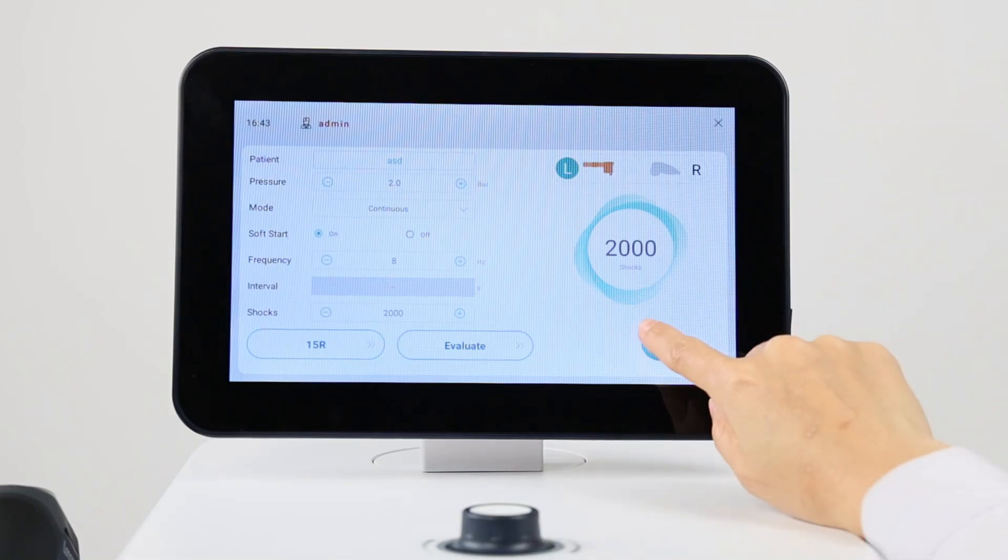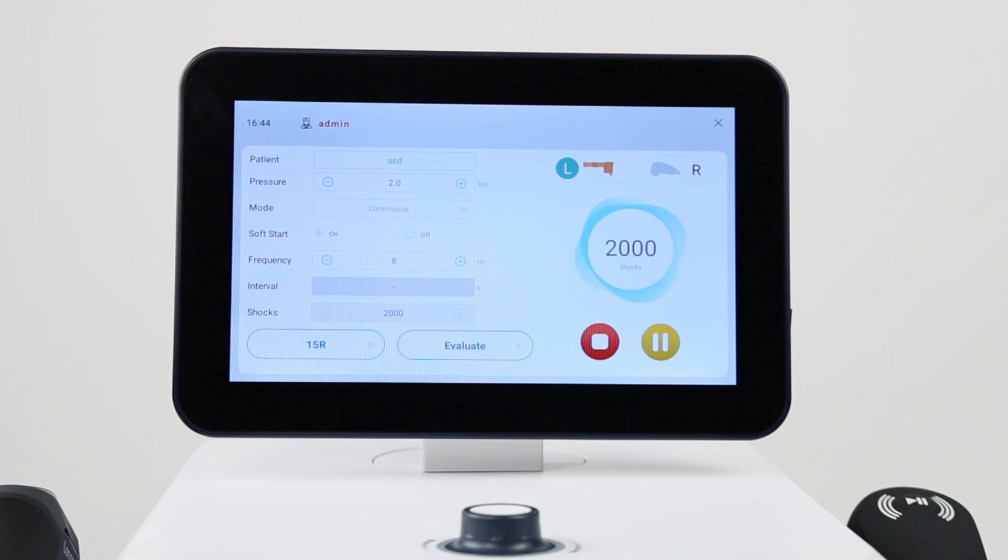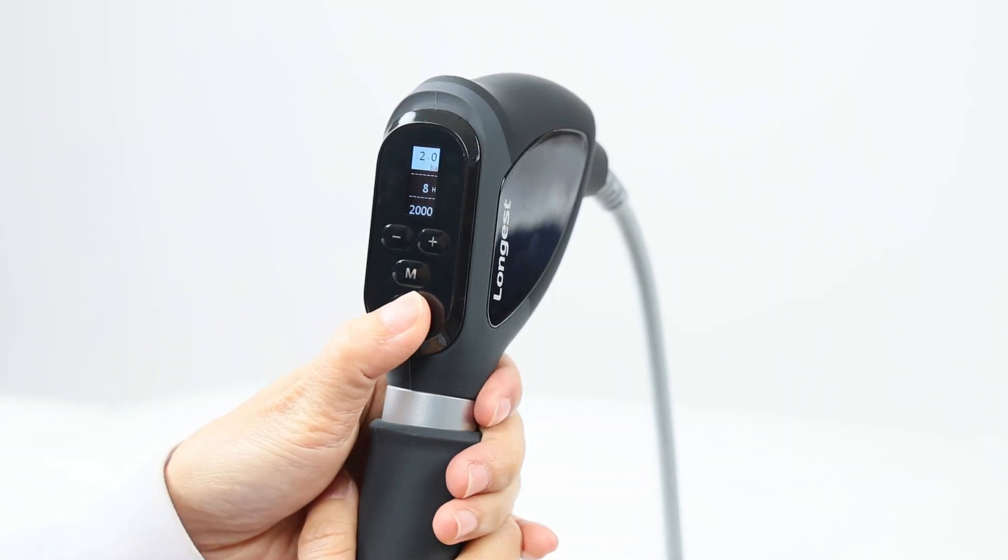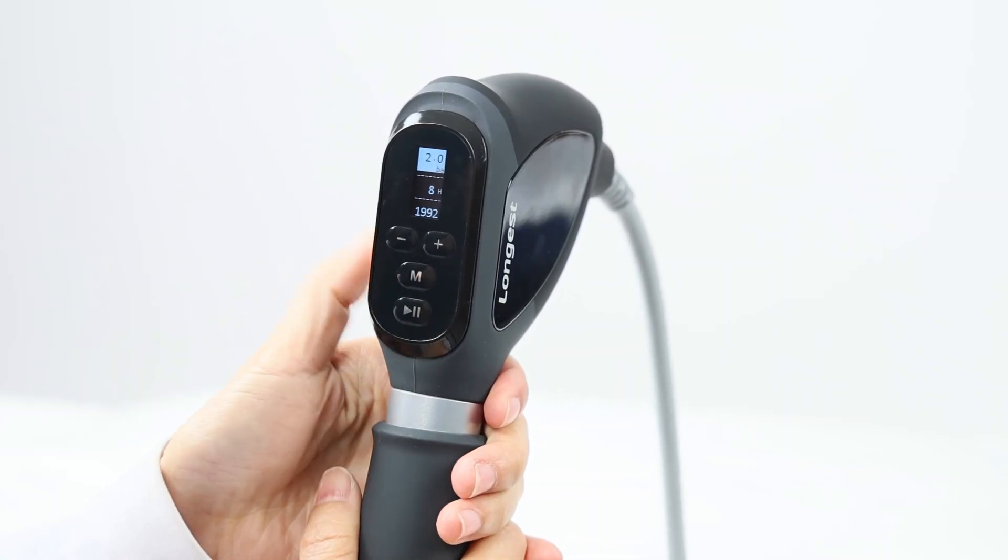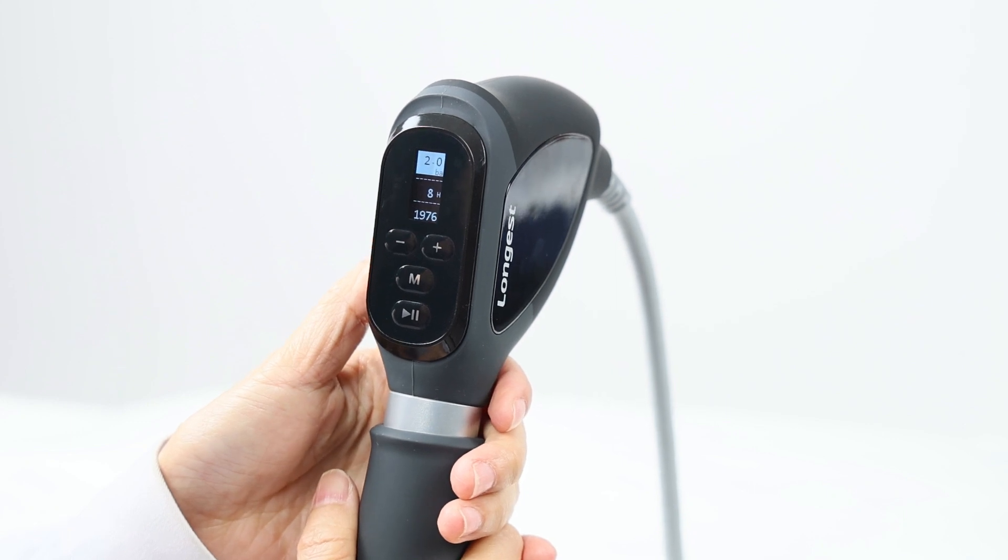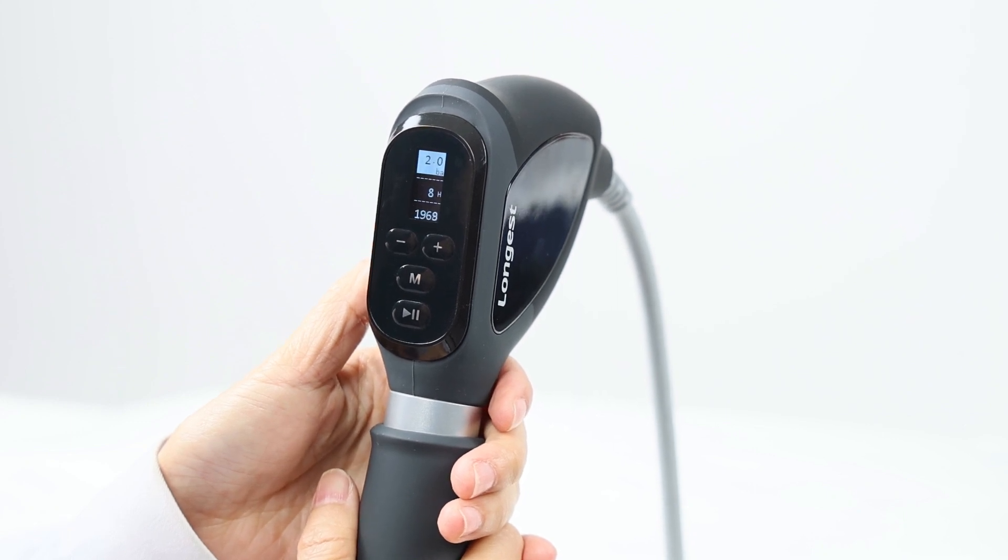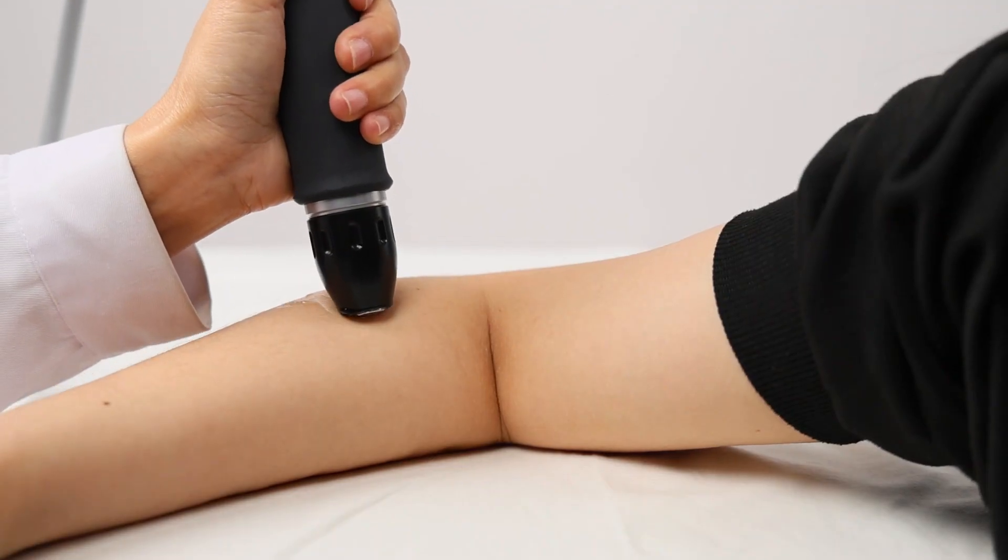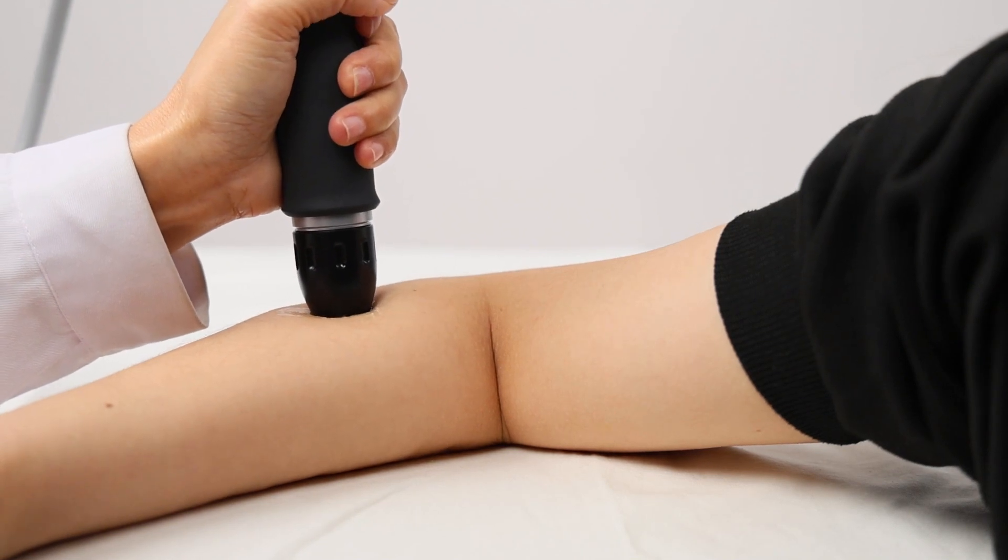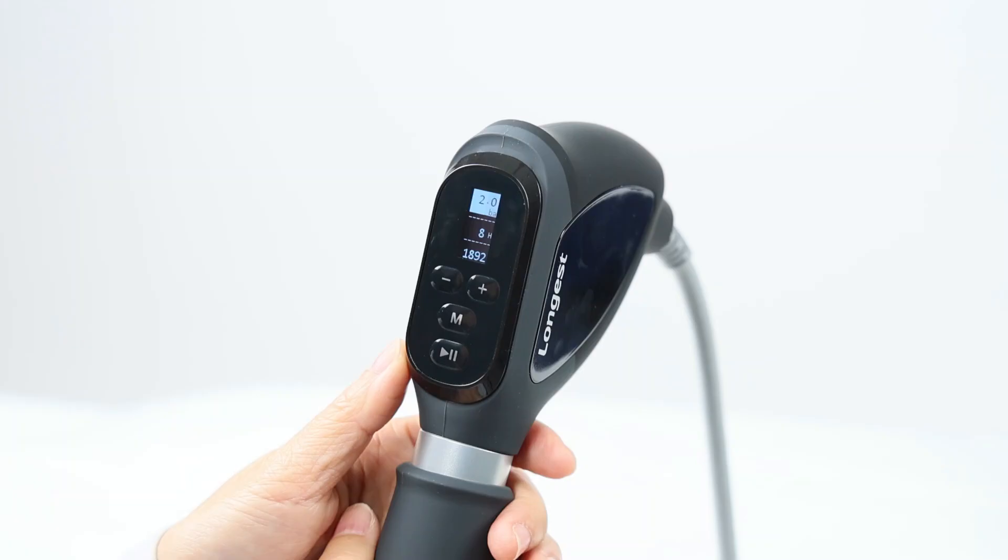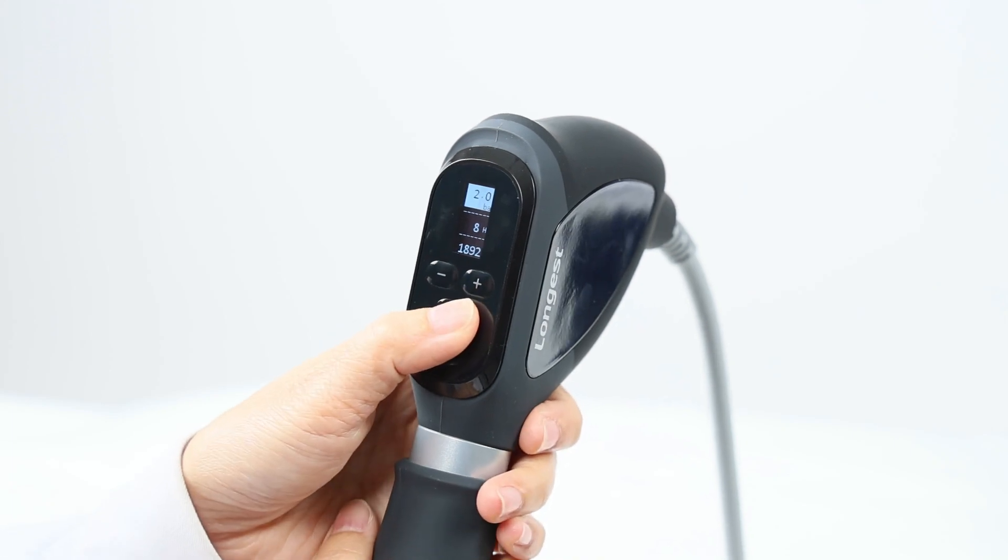With the setup complete, click the start button on the screen. And long press the start button on the handpiece to activate the handpiece to produce shock waves. Apply the shock waves to the targeted area. Continuously observe the patient's reaction to the treatment and adjust the settings accordingly.